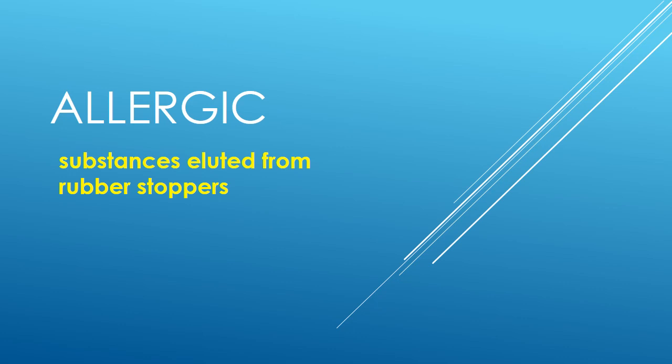And remember, all the substances present in the rubber stopper might get eluted into the contrast media solution, and that itself can lead to allergic reactions. Please pierce the rubber stopper only once.